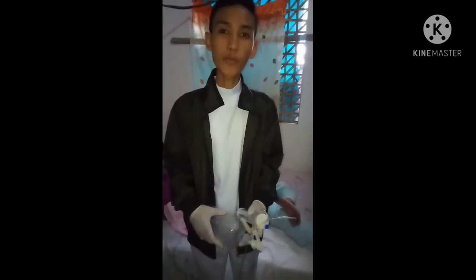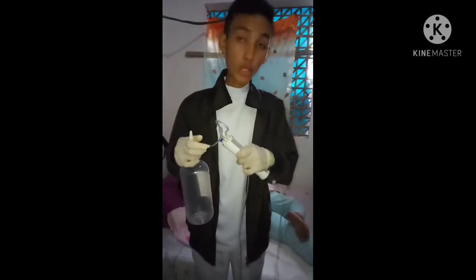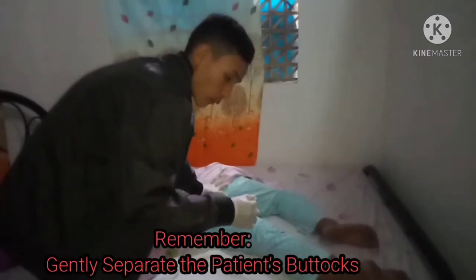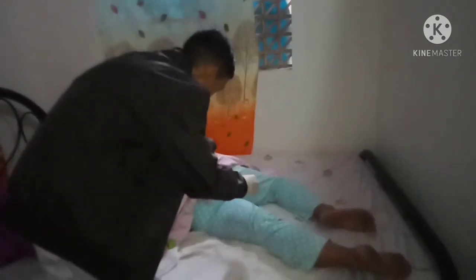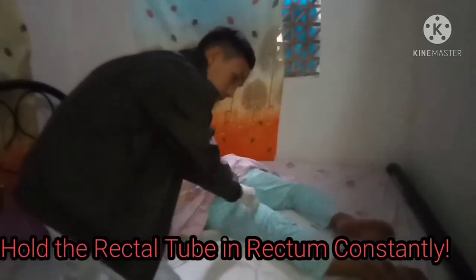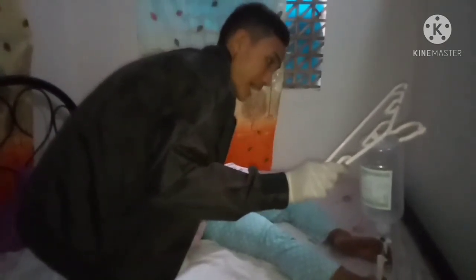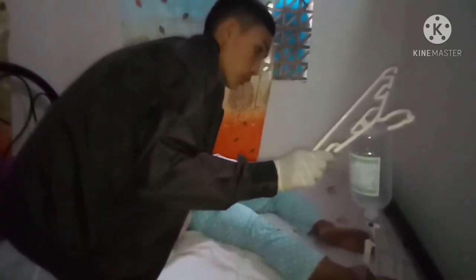For the standard enema procedure, we need to do the same procedure. So we need to remove the cap, lubricate the tip of the enema, wear gloves, and once again insert it 3 to 4 inches. Ma'am, deep breath please. While we are holding it, we need to raise the container at least 12 to 18 inches above the client's buttocks or hips. So we need to adjust this one.